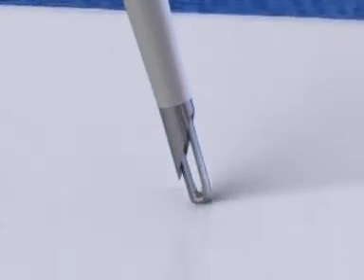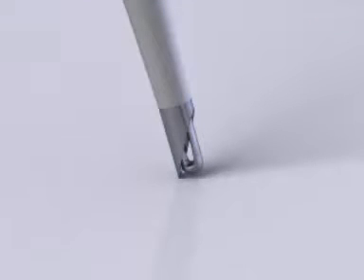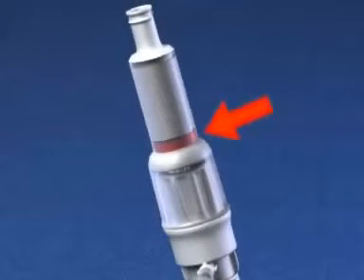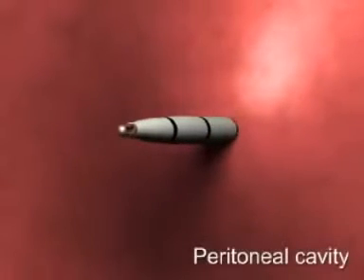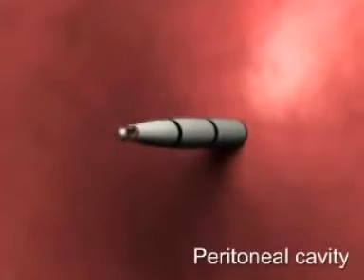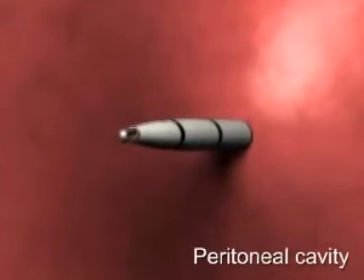When pressure is applied to the distal end of the device, the obturator retracts and the bevel of the needle is exposed, allowing penetration of the tissues. An indicator at the top of the device will turn red whenever the obturator is retracted. Once the peritoneal cavity is entered, the obturator redeploys. This safety mechanism theoretically reduces the risk of organ injury.